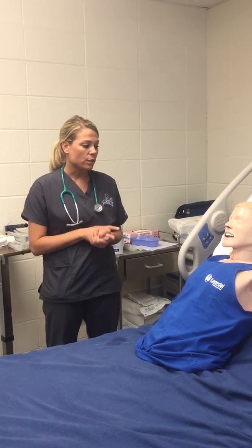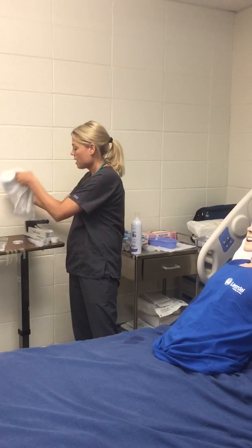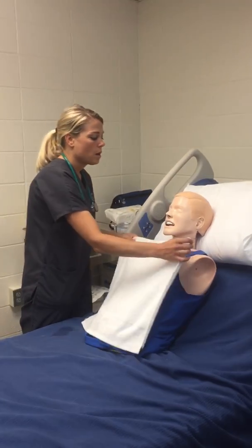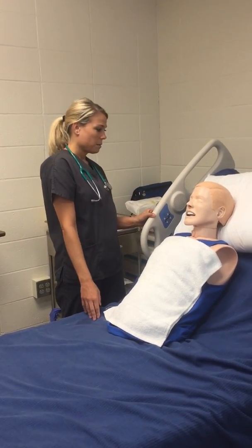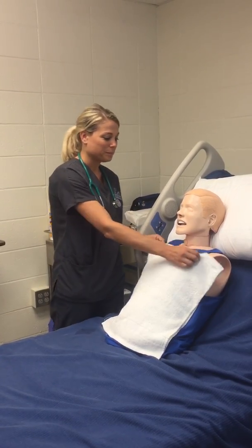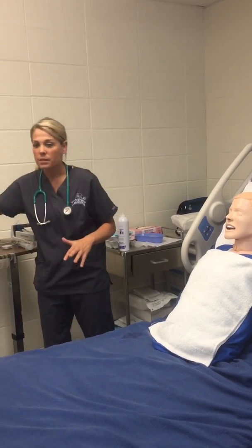So the next thing I will do is I'm going to go ahead and lay a towel on the patient's chest. This way it'll keep the patient clean. I'm going to assist the patient up in high Fowler's position. And then I am going to go ahead and don some clean gloves.